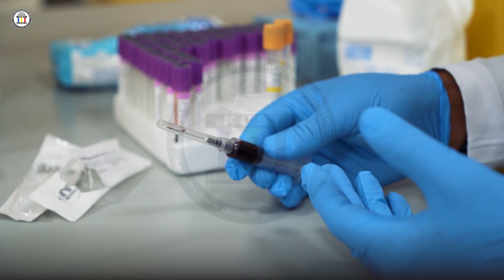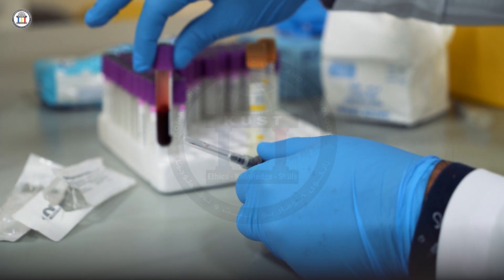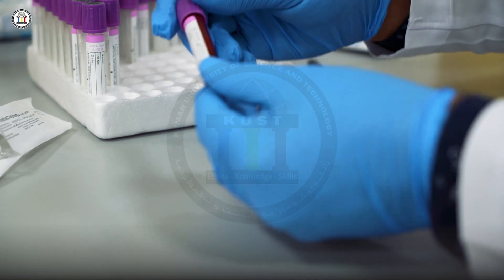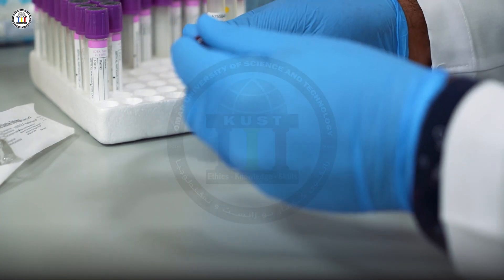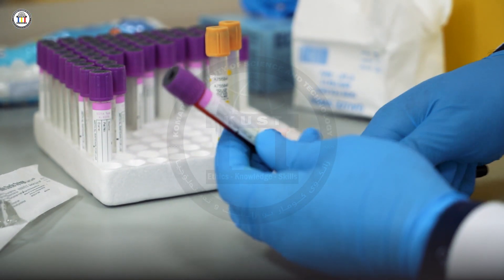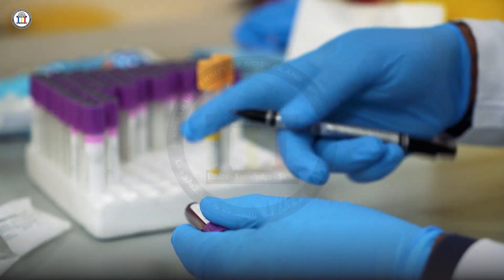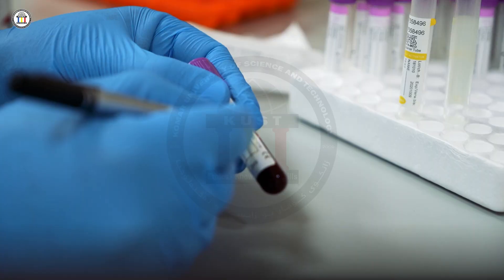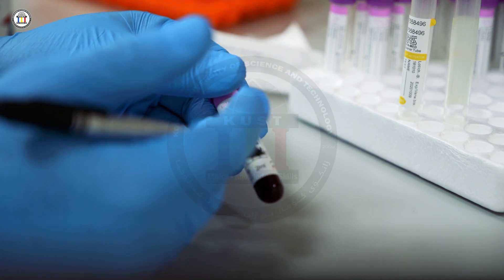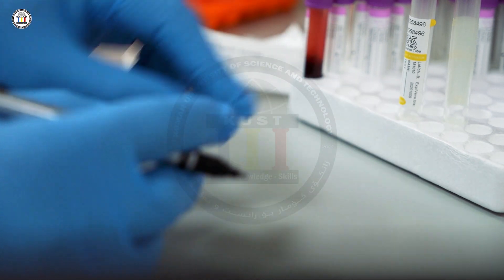If you need more blood you can transfer it to another test tube, but here we have a sufficient amount. After transferring blood to the test tube, perform mixing for about six to eight inversions. Then label the test tube — check the spelling against the request form, write the patient's name, date of birth, and other required information. Now the sample is ready for testing.